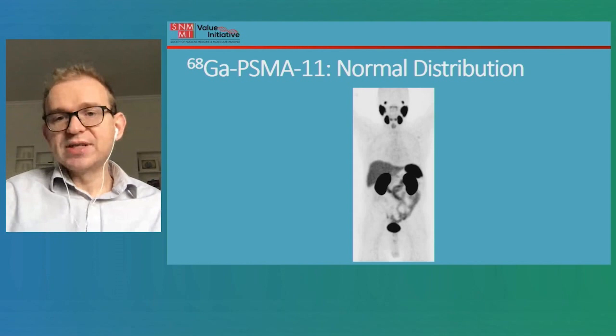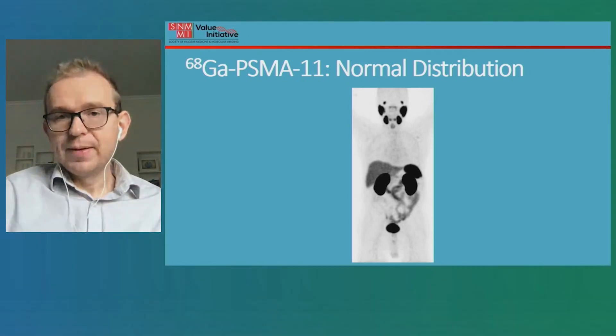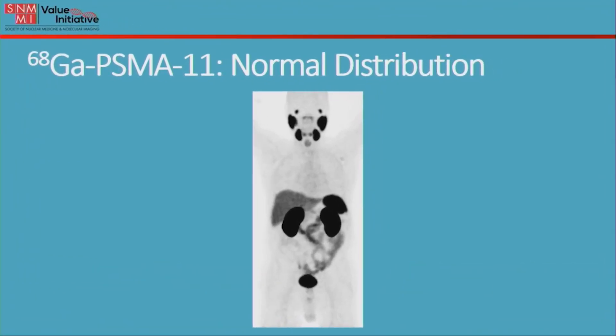Let's take a look at what normal PSMA PET images look like. In a typical PET scan, it doesn't look like a normal person because only some tissues light up. In the region of the head, we see a lot of lighting up of the lacrimal and salivary glands — the tissues that make saliva. There's very little normal uptake in the chest. In the abdomen, we see the liver, spleen, kidneys, bowel, and bladder — all normal, indicating the ways this tracer is cleared through the body.